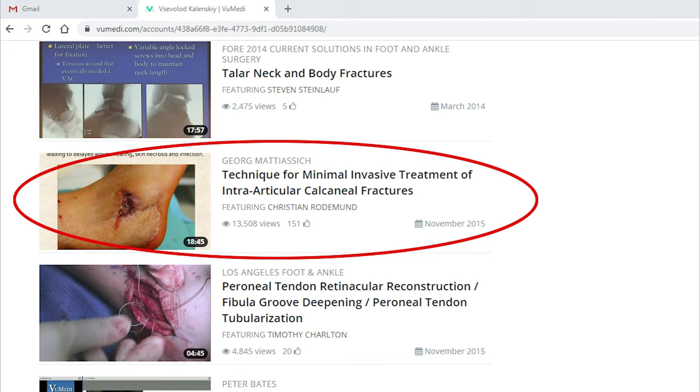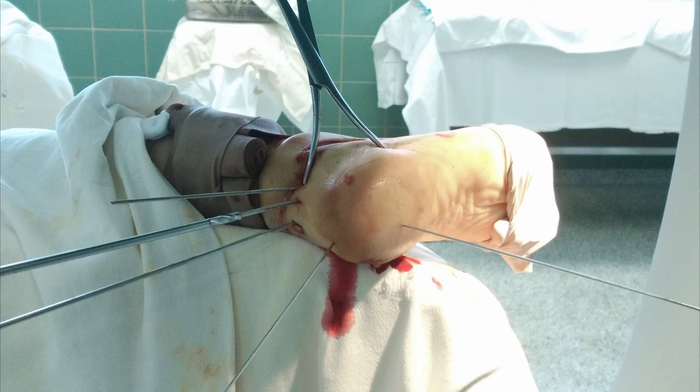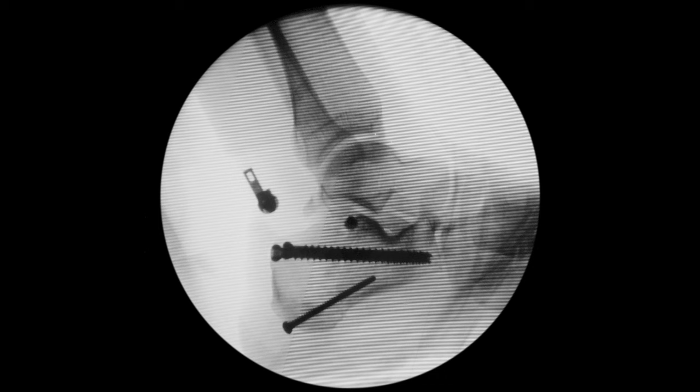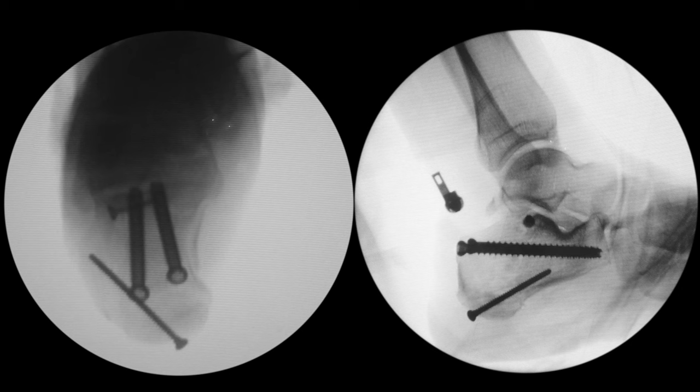We used a method of screw installation described by our colleagues from Austria — you can find it on the VuMedi website. It is a very elegant method of screw placement. It is important to know that the screw heads must be sunk into the bone; otherwise, there is a high risk that walking will be painful until the screws are removed. The last maneuvers are reduction and fixation of the lateral articular fragment through the sinus tarsi approach, and fixation of the tuberosity fragment with 3.5 mm screws.